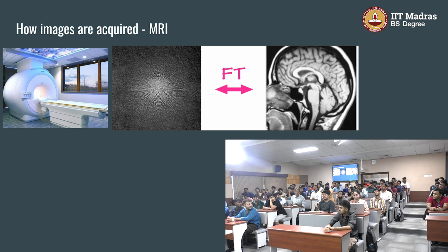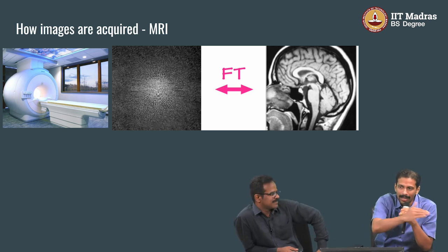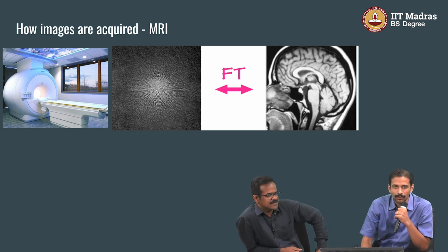In our body there is 65% makeup of water. Yeah, more than that. They show the dipole moment when the magnetic fields are passed. Yes, exactly. So, great, a good initial point. This is a starting point. But let me go back a little bit and explain to the others also.